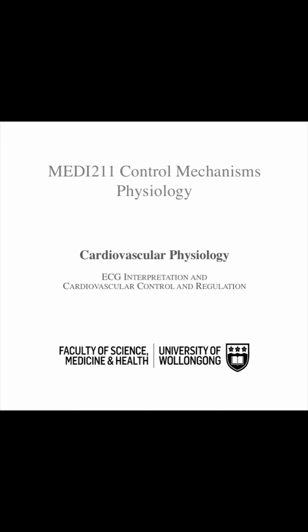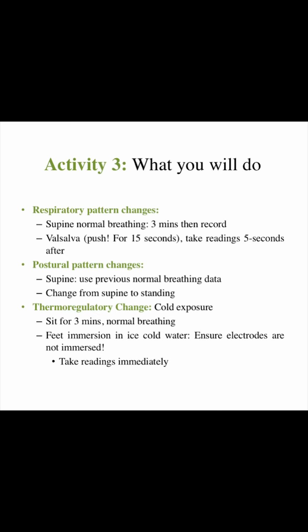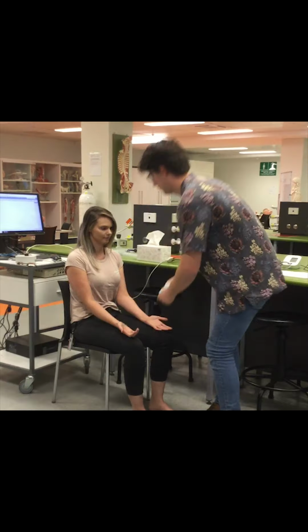In this video, we'll be completing the Cardiovascular Physiology Laboratory. We will begin at Activity 3 of the workbook, where we will look at cardiovascular control and regulation. This will consist of examining the respiratory pattern changes during a Valsalva maneuver, postural changes, and thermoregulatory changes.